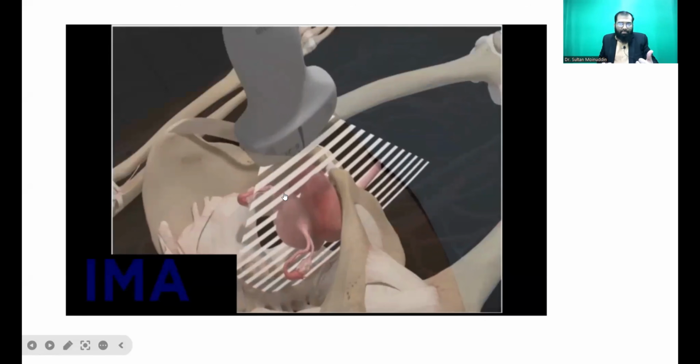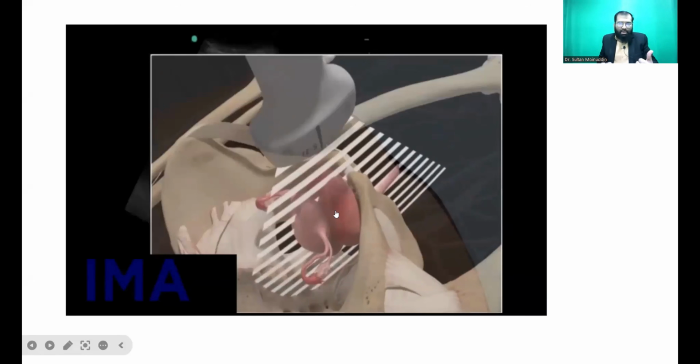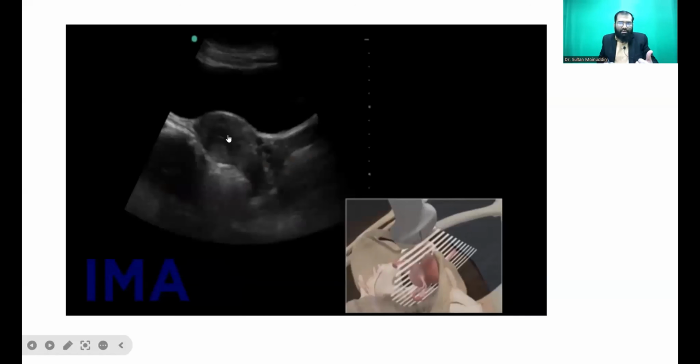You would be able to get this section along the uterus if you put the probe in this direction. So this is the section which is obtained. From anterior to posterior, this demarcates the anterior wall of the abdomen. And this entire organ, anechoic, is the urinary bladder. Anechoic means completely dark. Now this green marked organ is the uterus with the vaginal canal.